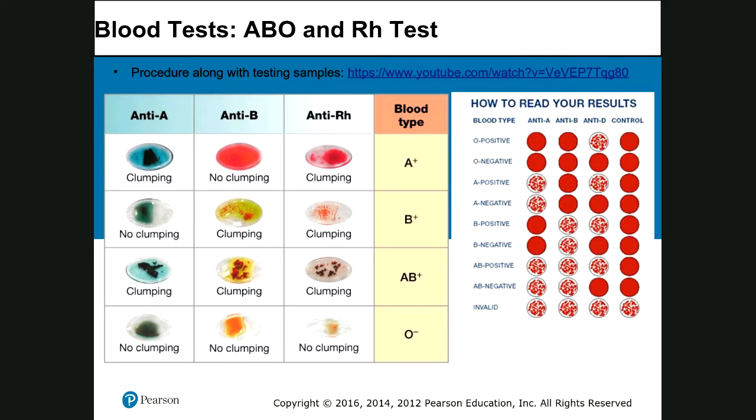type blood, and when I put it with an antibody anti-B, there are no agglutinations or no clumping. So this is proof that this is type A blood. And in contact with an anti-D, which is an anti-rhesus, it clumps, which means that it is rhesus positive. So all this, I wanted to train with you.